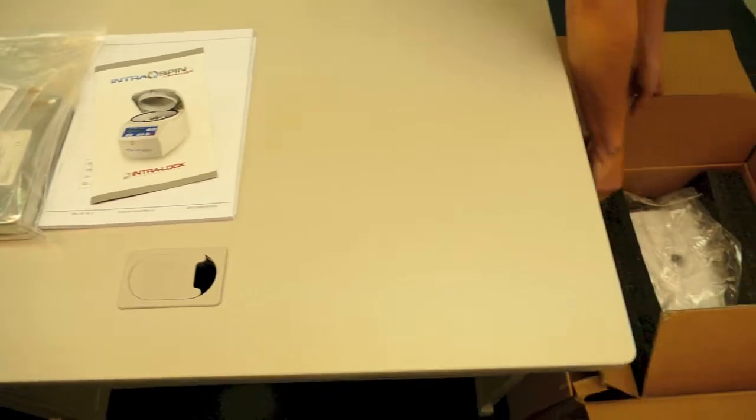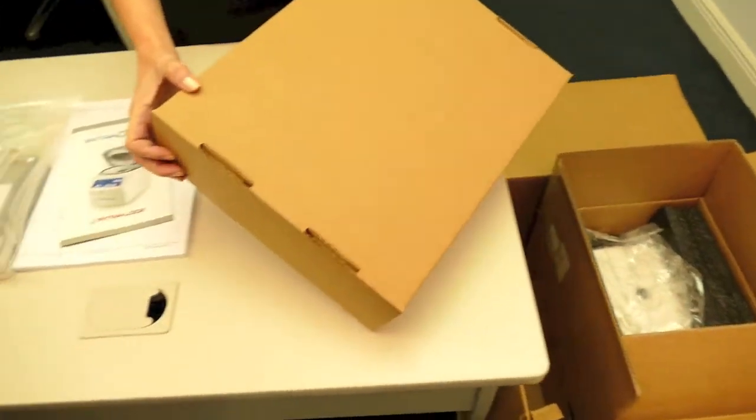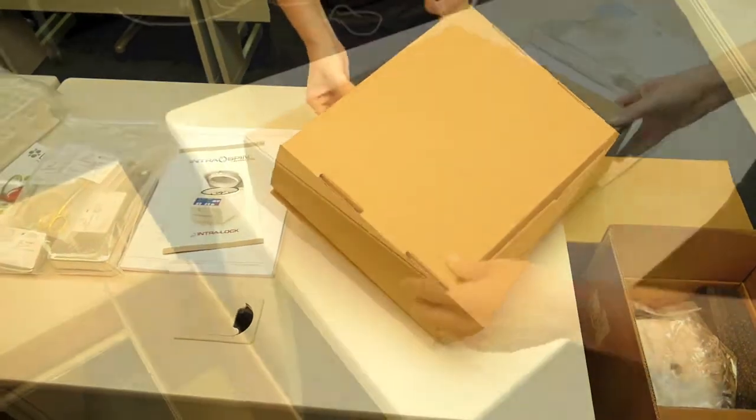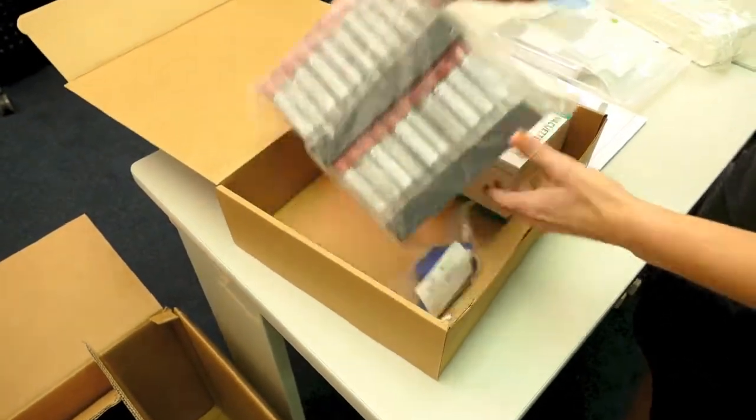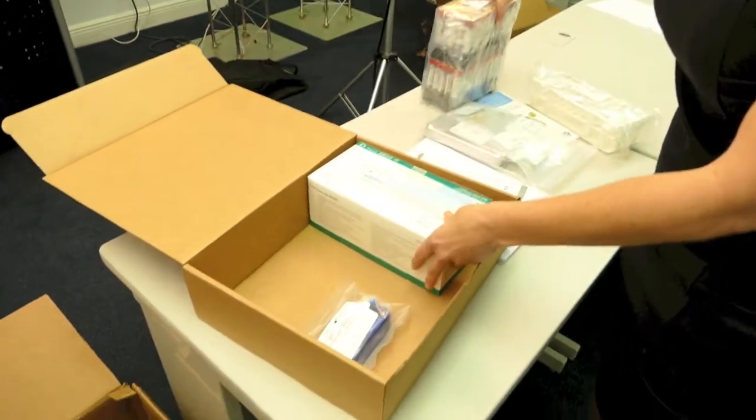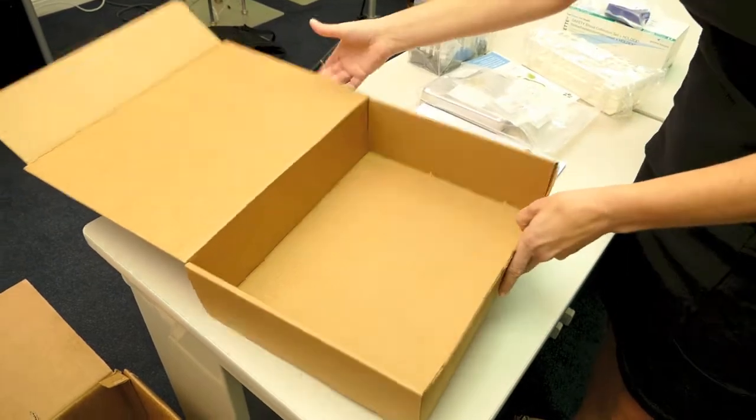The next thing you're going to do is remove the next box. This is going to contain your blood collection kit. One hundred vacutainers, twenty-four of the butterfly needles, and one tourniquet. We're going to place those aside.